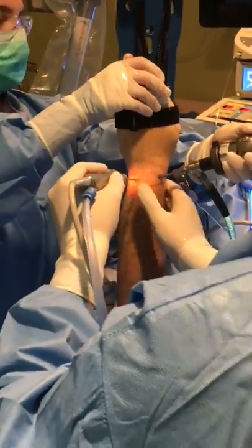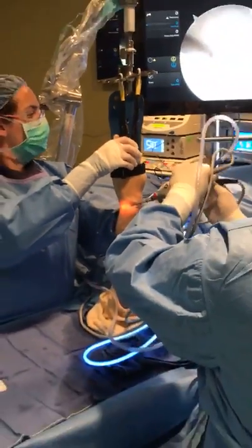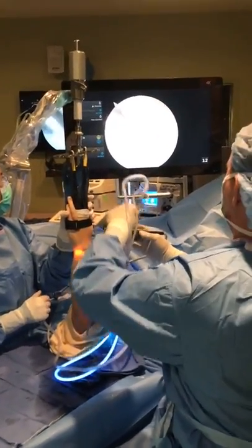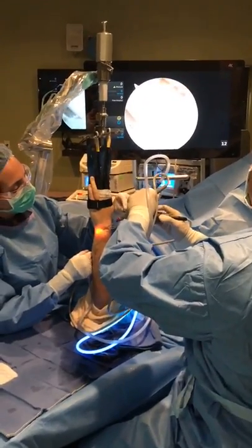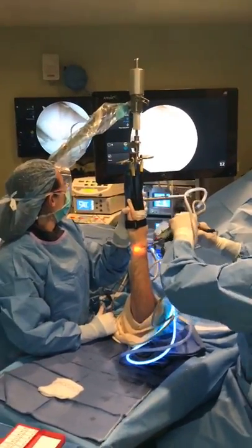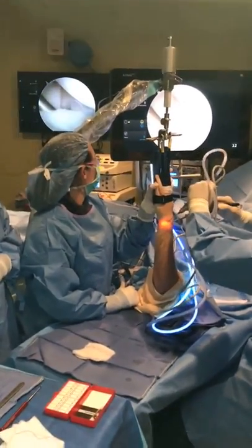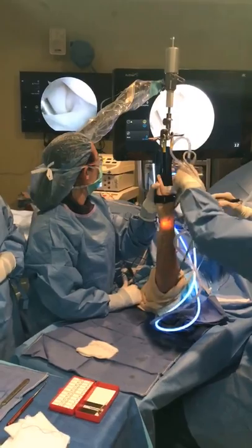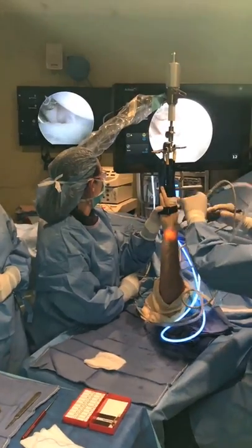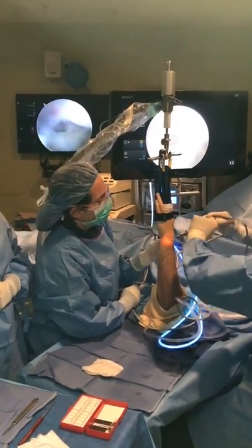So if any of my colleagues were watching saying, oh my God, you should put an anchor into the fovea, my answer is I do this. I will clean up and create scarring deep, so that the deep fibers to the fovea of the ligamentum subcruentum, to me, that's enough. That's a very vascular part of the cartilage, so that will scar and heal. What I want to do now is reattach this here.